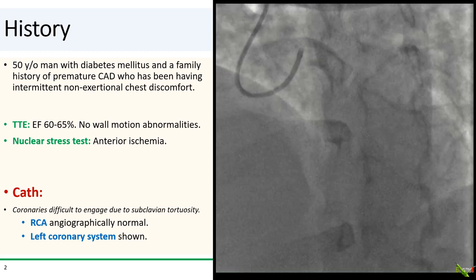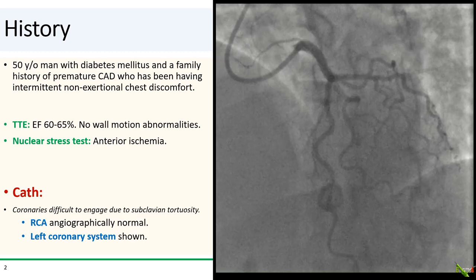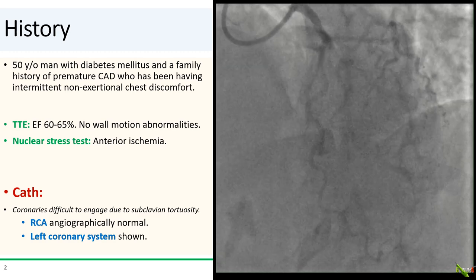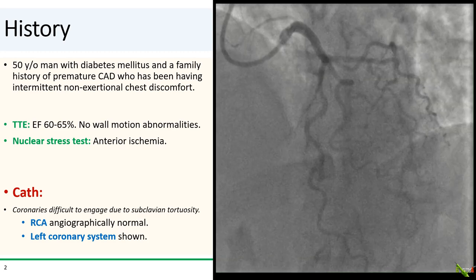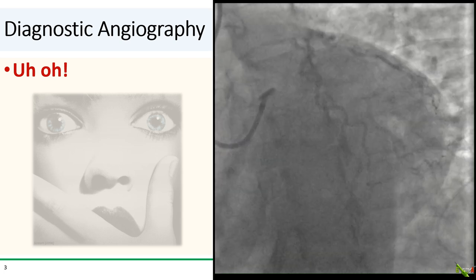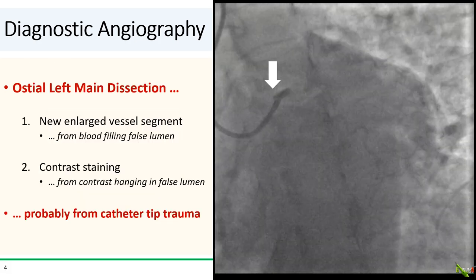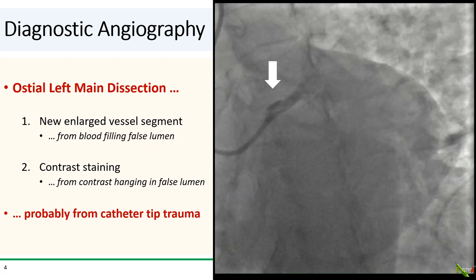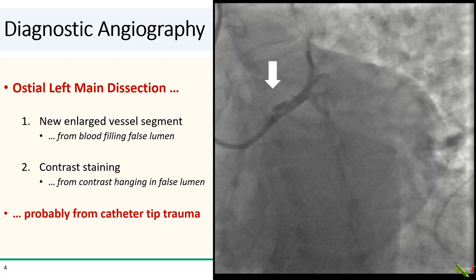You'll notice how the EBU catheter is a little bit roofed, angled up and digging into the wall of the left main. But angiographically, the left coronary system looked fairly normal as well. And here is the spider view. This is not good. What we see is a dissection at the ostium of the left main, probably from trauma due to the catheter tip.